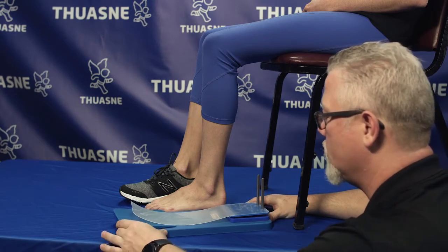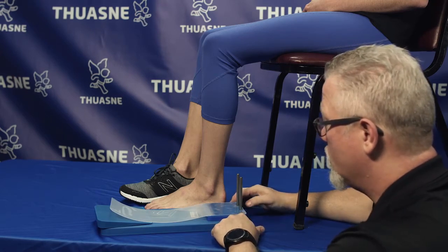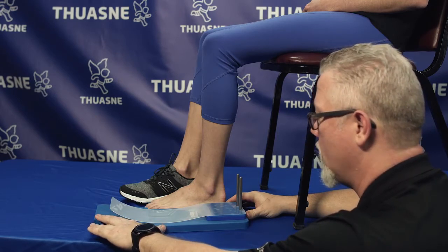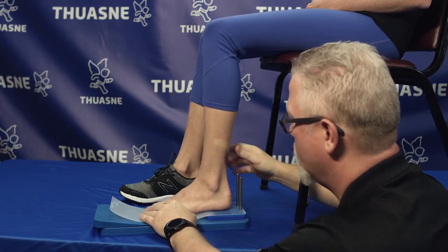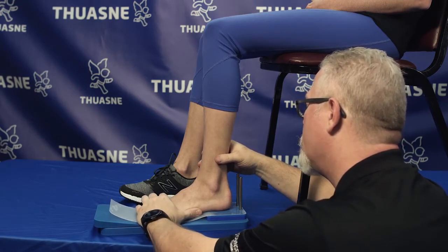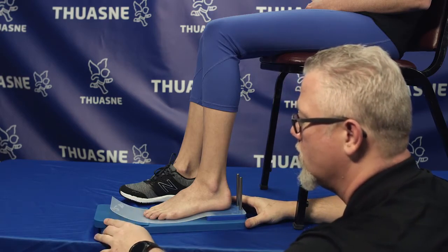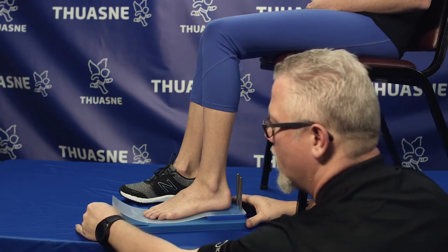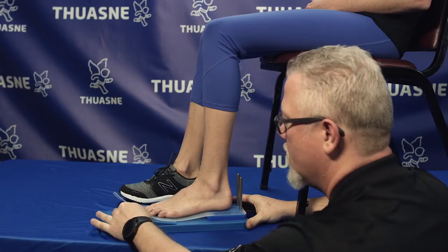patient. It's essential to go ahead and use the exact number for the heel height to place on your casting block. You also need to ensure that we have added the toe extension board as well. We're going to place the patient on the casting block, ensuring that we don't get too close to the metal pegs. We're going to make sure the patient is centered within the casting block itself, and we need to work on our toe extension. Now, the toe extension, just like when you measured, we're going to use the metatarsal break. So the edge of the toe ramp will slide like so till we get center metatarsal head.